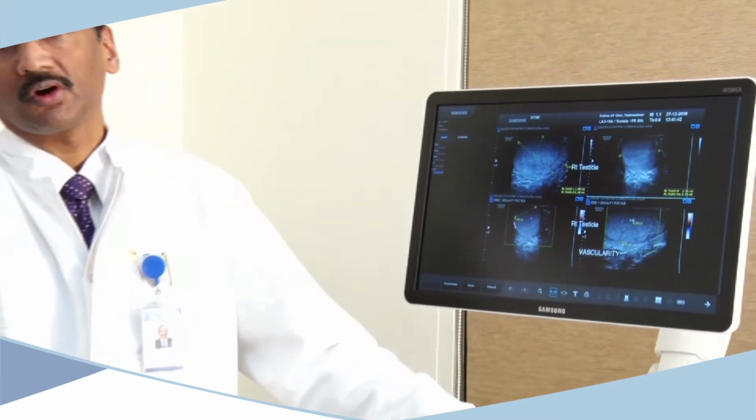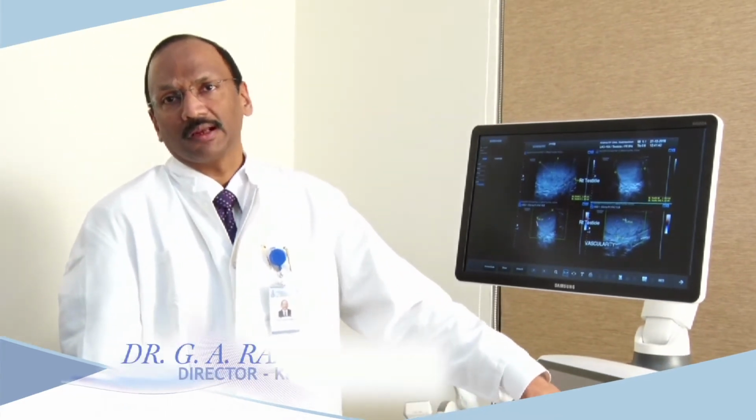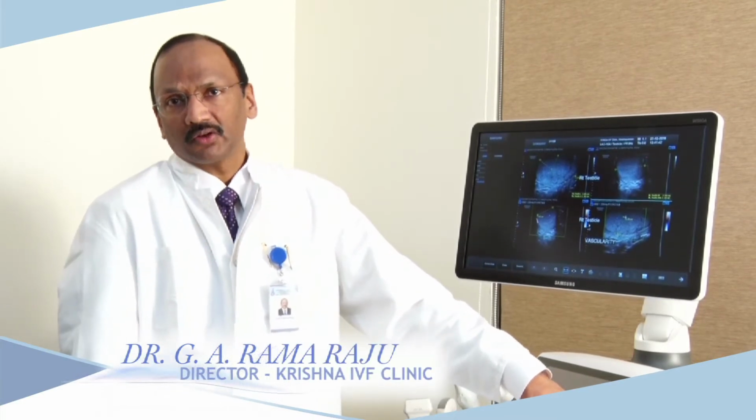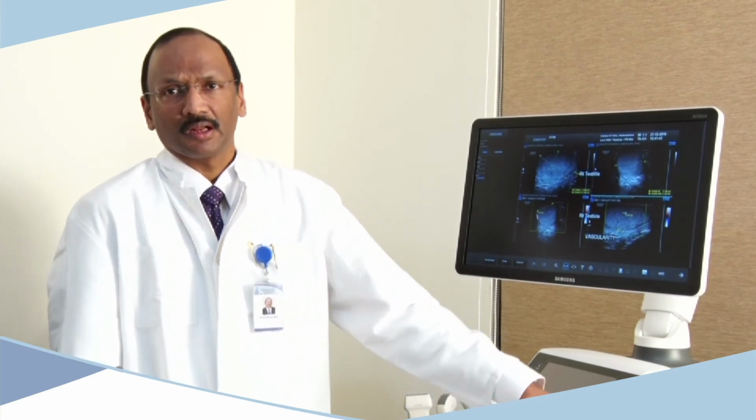So using scrotal ultrasound will help us to find additional causes of male factor infertility. It also helps us to find out whether that particular problem can be treated with medication or only technology can be used. And the third thing is whether the count is going to get reduced in future. These are the uses of a scrotal ultrasound in the current context.